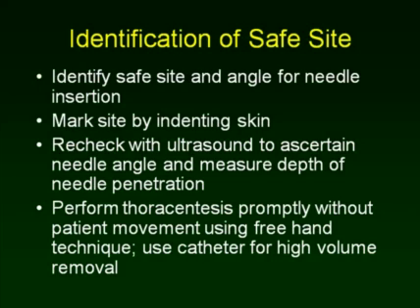Once the site is marked and the patient is fully prepped for the thoracentesis, it's very important to check again. And the thoracentesis should be performed promptly without any patient movement between scan and needle insertion.